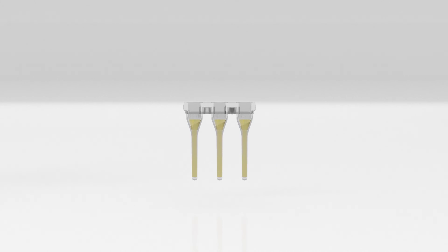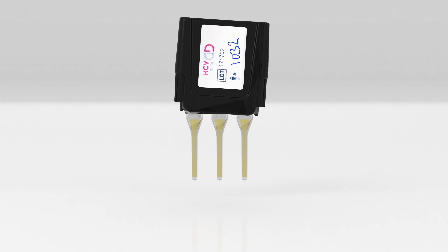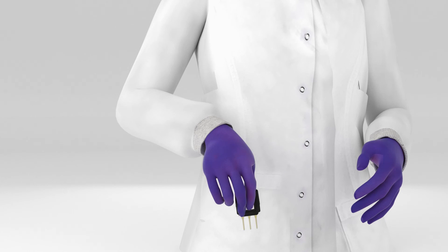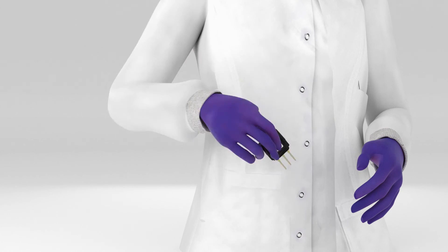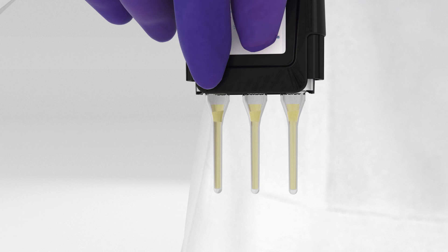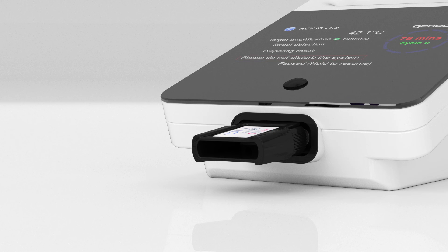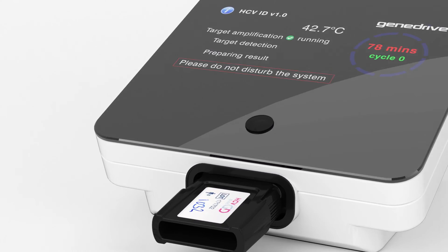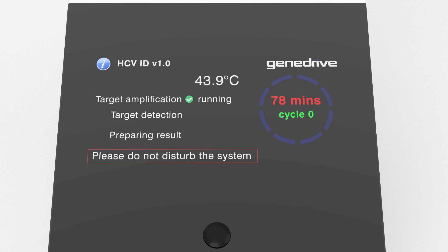Attach the new GeneDrive lid and ensure the lid is fully engaged on both sides. As before, firmly flick the cartridge downwards to force the samples to the bottom of each channel — this mixes the prepared plasma and RT-PCR reagents. Inspect the cartridge to confirm addition of the reagents and immediately place into the GeneDrive instrument, ensuring it is fully inserted into the cartridge dock. Press and hold the function button until a beep is heard. The instrument will follow a predetermined RT-PCR thermocycling pattern, specifically developed for the HCV ID kit.